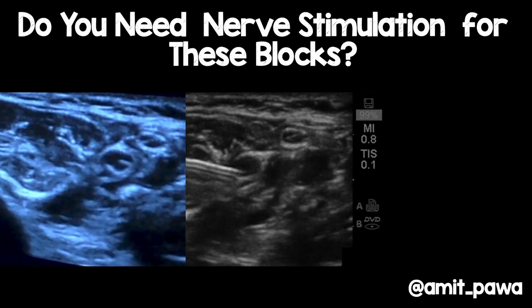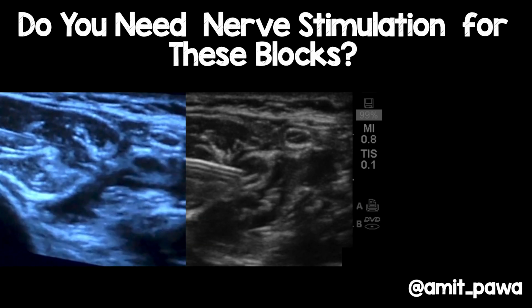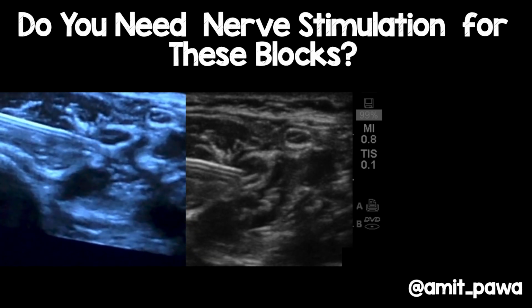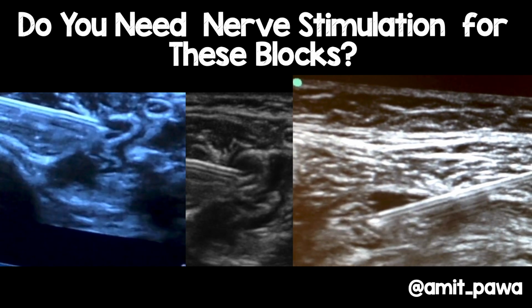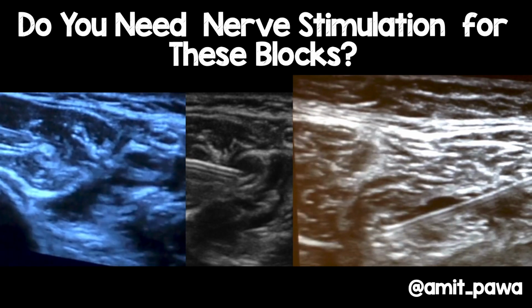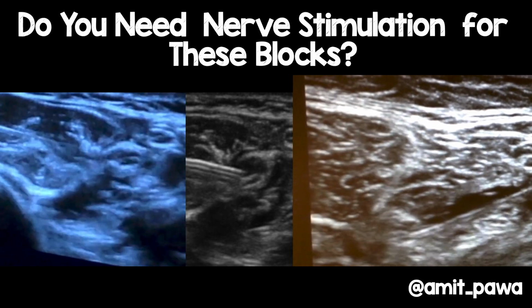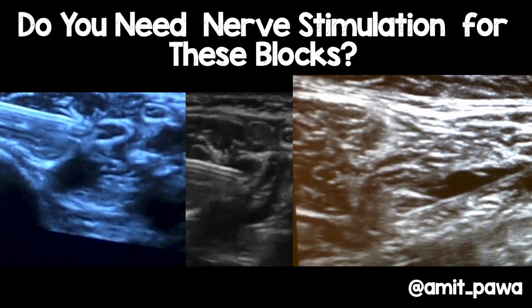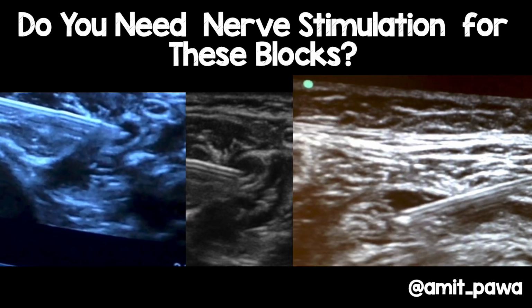Let's look at these videos over here. You can see the needle approaching some areas in the interscalene region. In cadavers, don't worry. Oh my God, look at this. Do you need nerve stimulation to tell if that's bad practice? How about this tibial nerve here? We're getting the needle, which is going to pop through. Oh my goodness me. Can you see that? Does nerve stimulation add anything there? I would say no. Ultrasound can tell you that that needle has gone intraneurally.